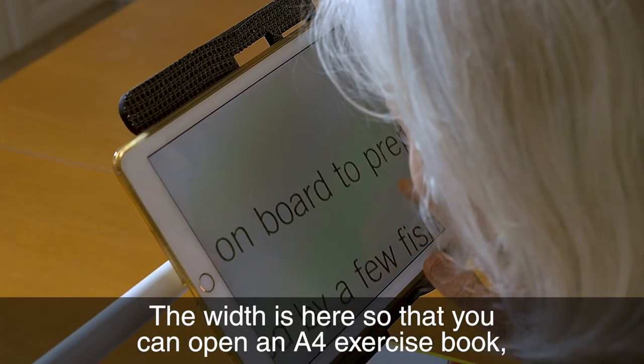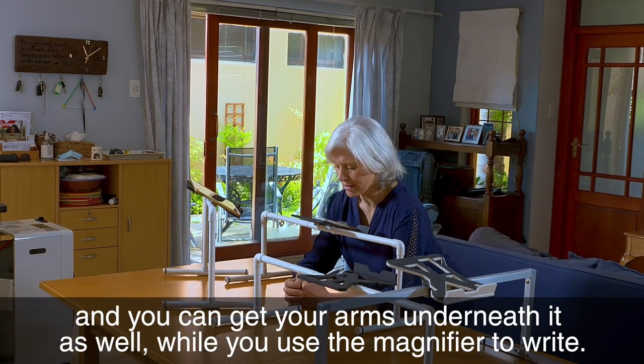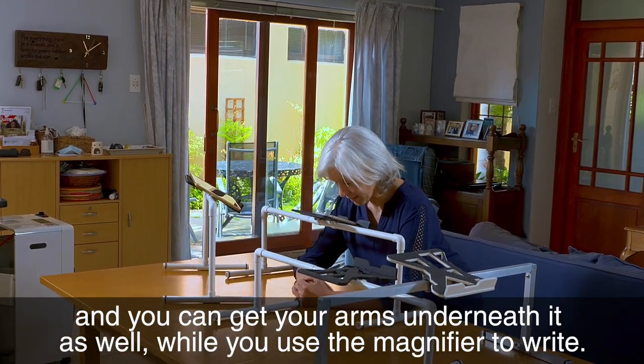The width is here so that you can open an A4 exercise book and you can get your arms underneath it as well while you use the magnifier to write.